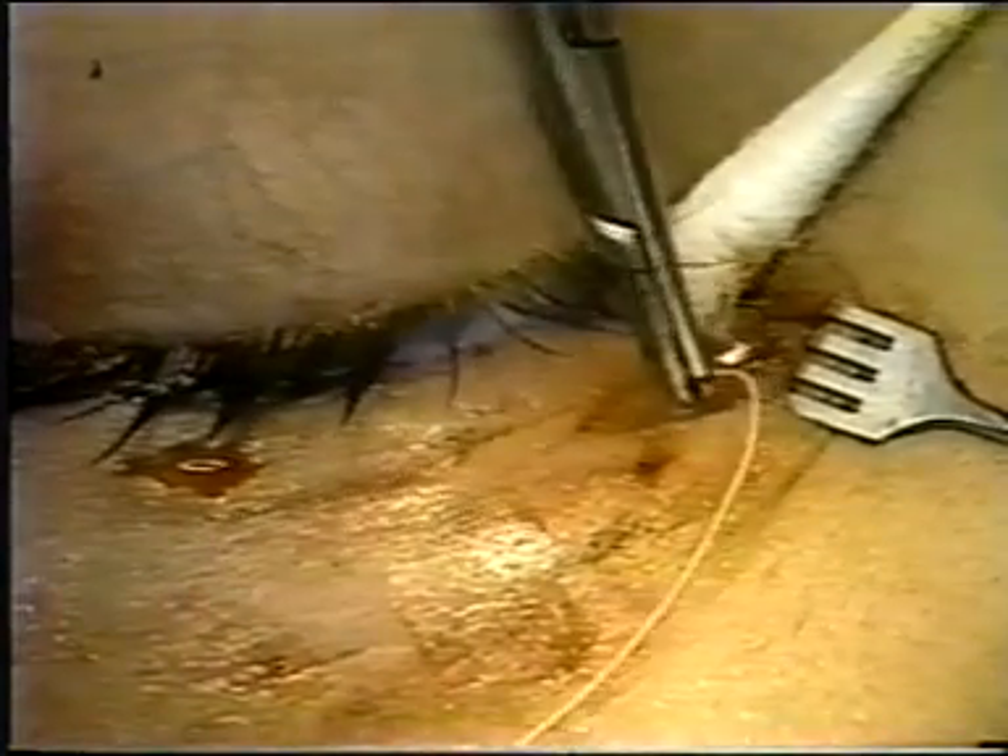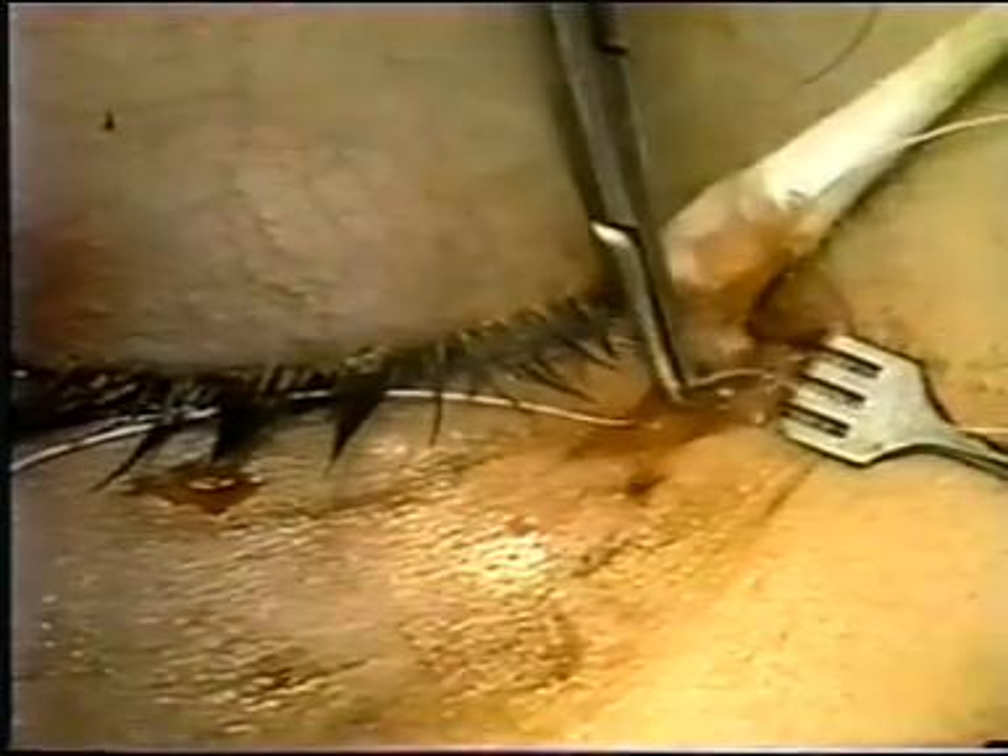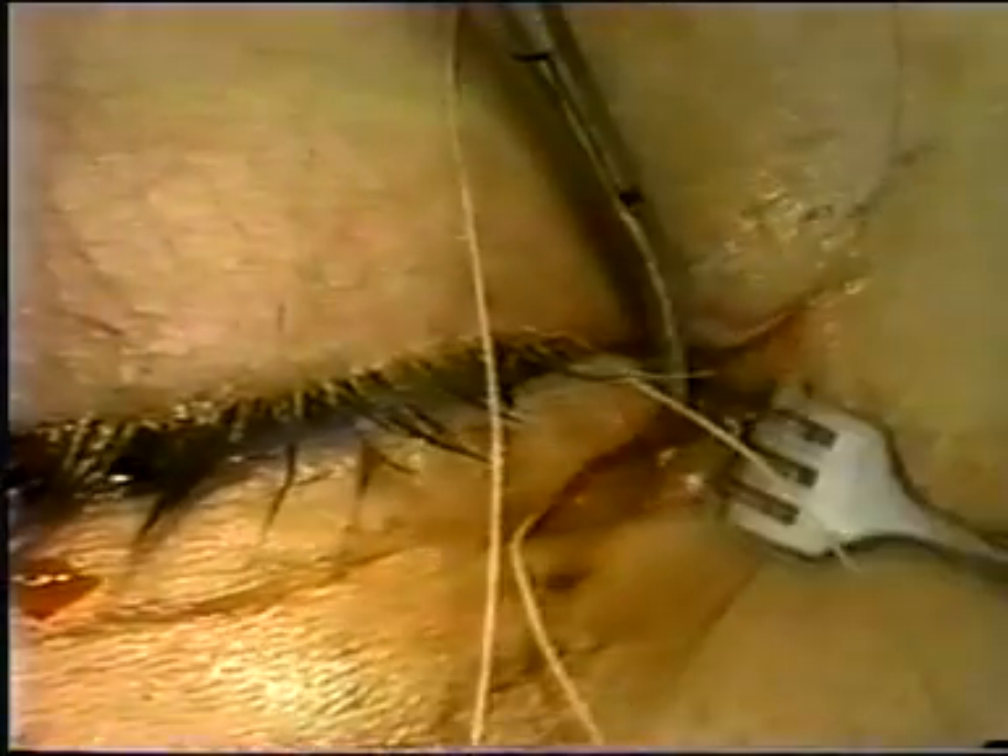Here we see the second suture being placed. At the end of the procedure, the lid should be in excellent anatomic position with the punctum in its normal position within the lacrimal lake. It is unusual to need more than two sutures to hold the lid in place.